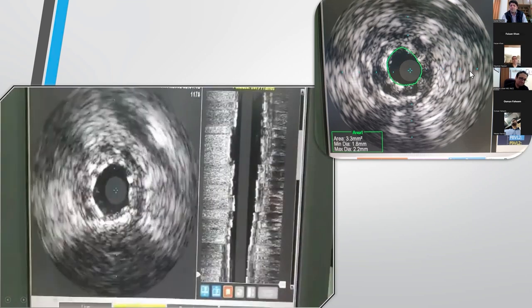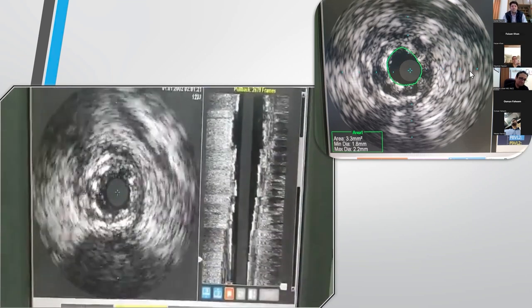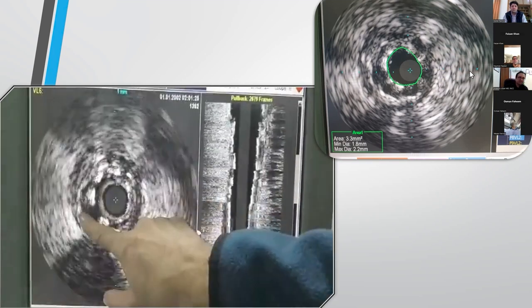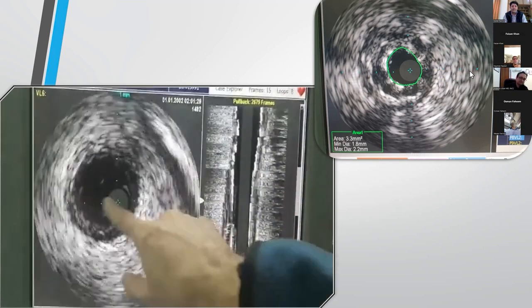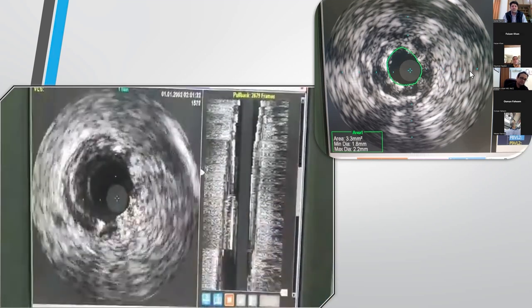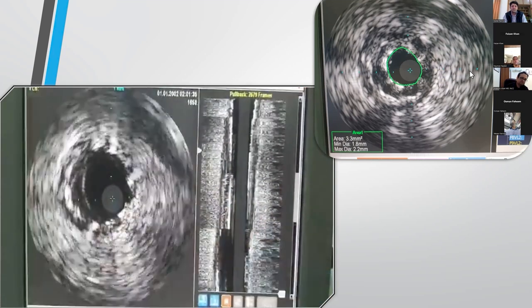The stent looks well opposed and reasonably well expanded as well. ये अब आपने contrast दिए. यहाँ पे under expanded है और malopposed भी है. ये देखें, contrast जब दिया था तो stent के पीछे भी नजर आ रहा है. ये वो area in between the stents जो कि stented नहीं है और दोबारा ये proximal vessel का stent नजर आना शुरू हो गया, which looks well opposed.